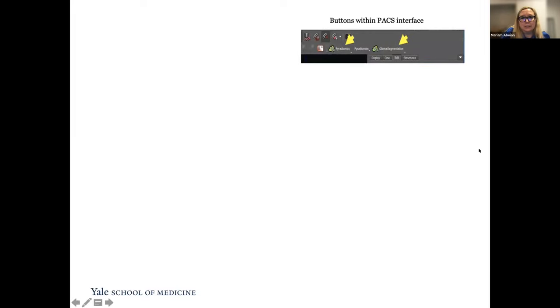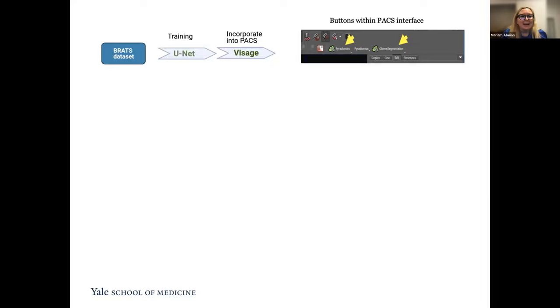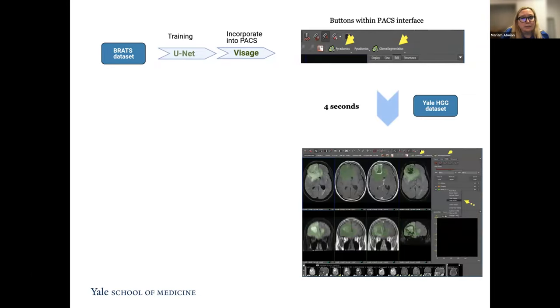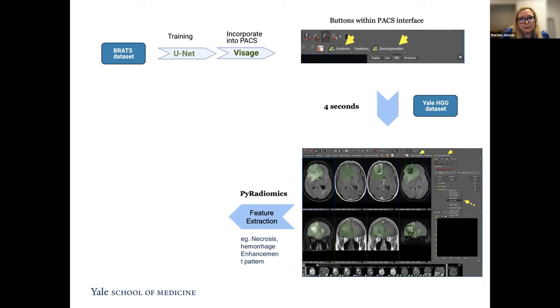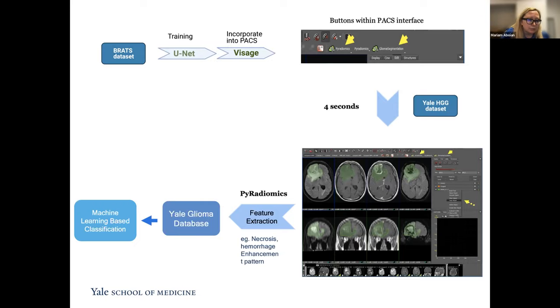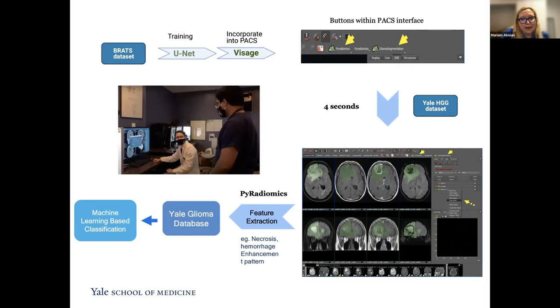Here are the buttons we use — they look very simple, but they're actually very complicated and took quite a while to code. For our glioma segmentation button, we use a U-Net algorithm trained on the BRATS dataset. Within four seconds, this algorithm segments our gliomas, and then we can copy and paste them on all sequences to get multimodal data. We also have a button for PyRadiomics feature extraction, which extracts data in a JSON file — that's how we're building the Yale Glioma database, which we're using for machine learning-based classification tasks.